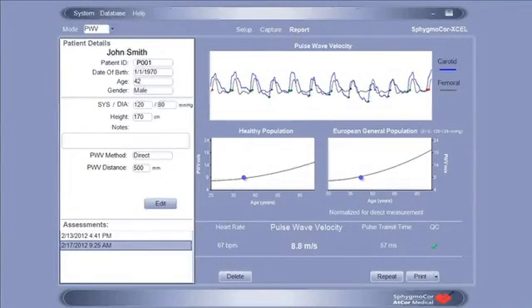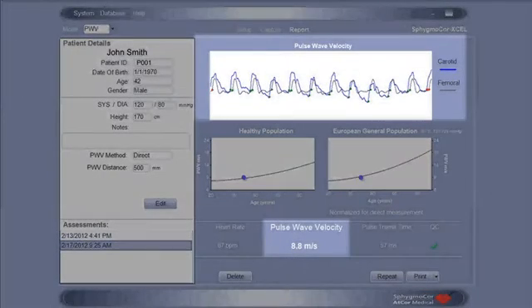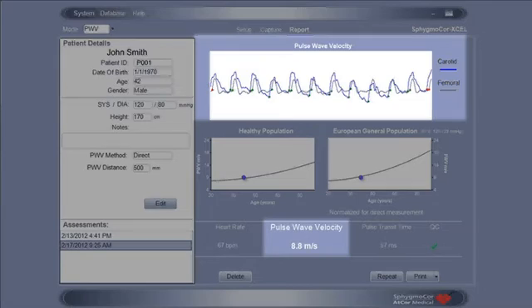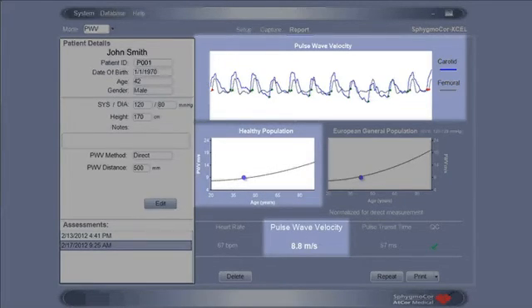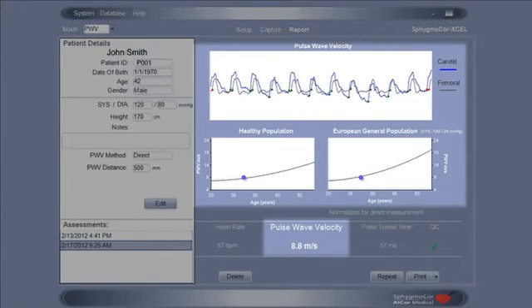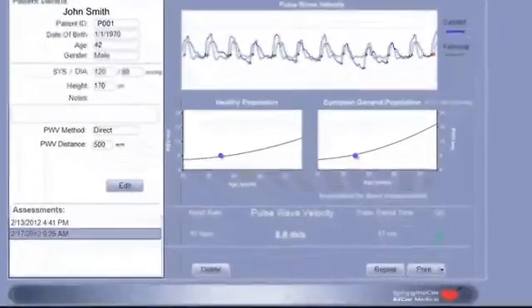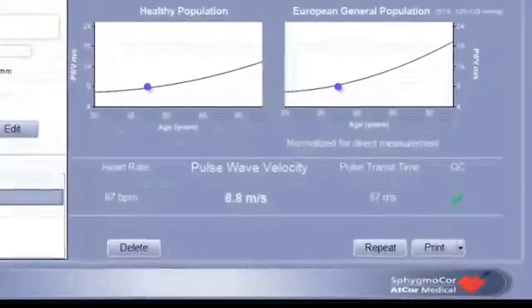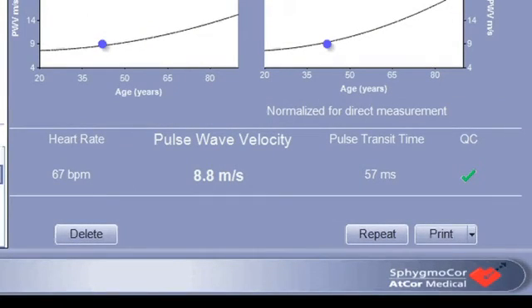Measurement results appear on the SphygmoCor XL Pulse Wave Velocity Report screen. The patient's pulse wave velocity in meters per second will be displayed, along with a graph comparing their measurement with healthy population data. If the patient's height and brachial blood pressure are entered, the patient's pulse wave velocity can also be compared with European general population reference values. The quality control screen informs the operator whether an acceptable measurement has been performed; if a green check appears in the quality control box, the measurement is acceptable.